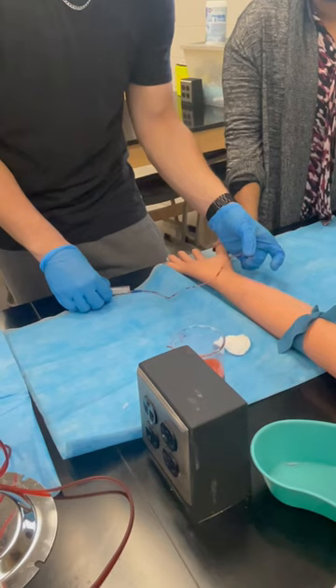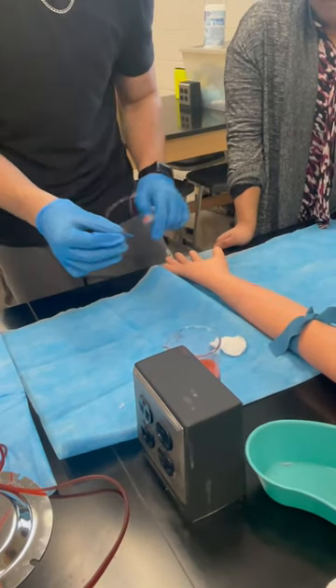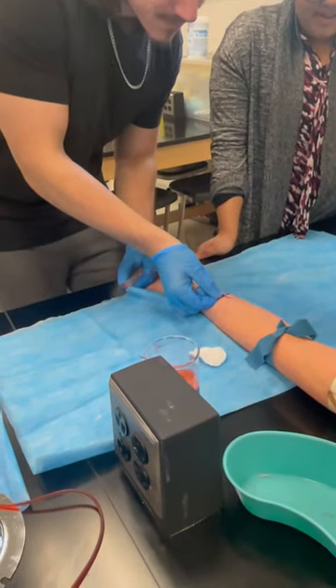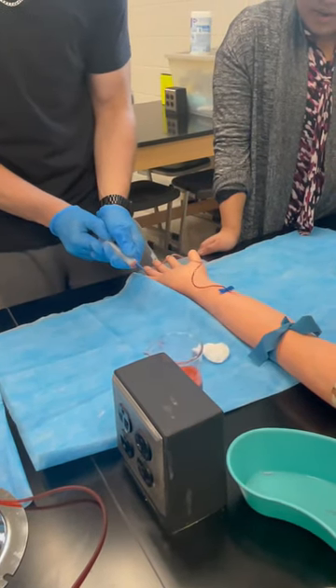Are you left-handed or right-handed? Right-handed. Then use your right hand to guide the needle — I think it'll go easier. Let's see if you got it. Draw back. Much better.